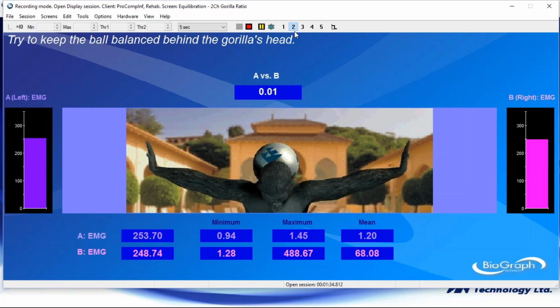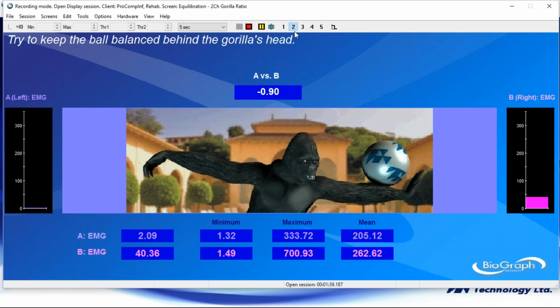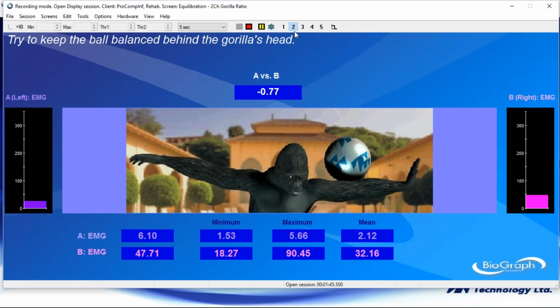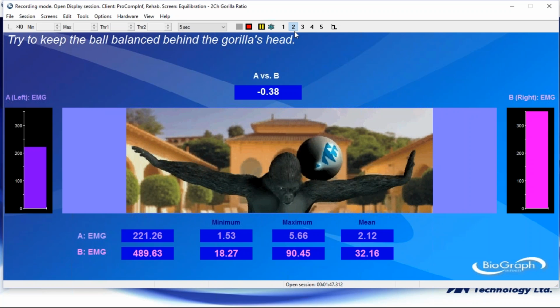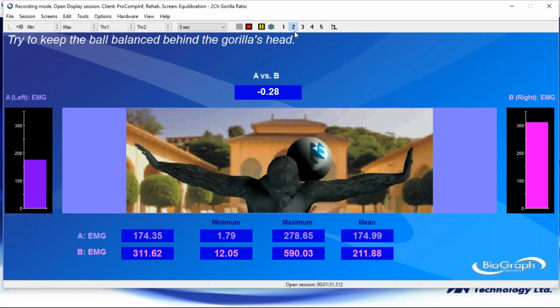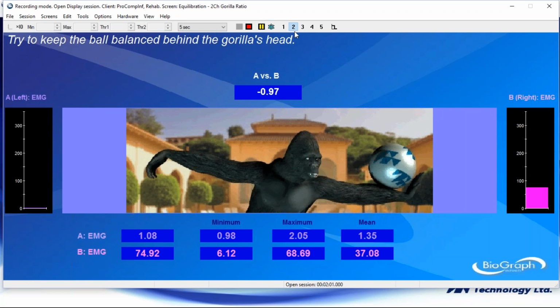And we'll see that they're pretty balanced, and then I relax. And we'll see if one holds excess muscle tension. Well, it looks like it's happening a little bit on my right-hand side. And then we'll do it again on 3, 2, 1. And relax. So again, with muscle balance, we can change the speed of the animation so it slows down a bit. But it's really just going to be about the real-time feedback.